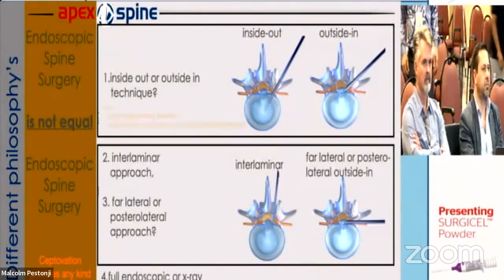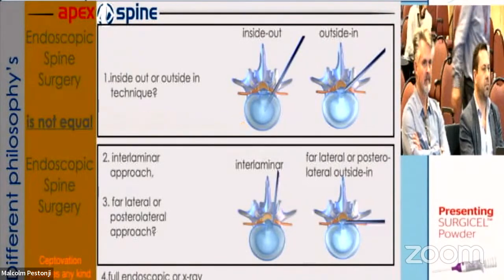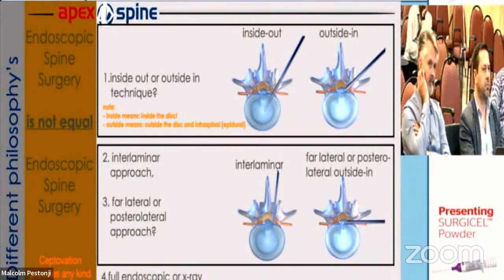What is the different philosophy? And again, I will show you that endoscopic spine surgery is not equal to endoscopic spine surgery. First, we have the inside-out or outside-in technique. What does it mean? Inside means inside the disc. That means, for example, with the YESS from Tony Young, Young Endoscopic Spine System, or the Vertebris system, the philosophy is first to go into the disc and then maybe with a decompression, you remove the disc herniation and you can treat the nerve.